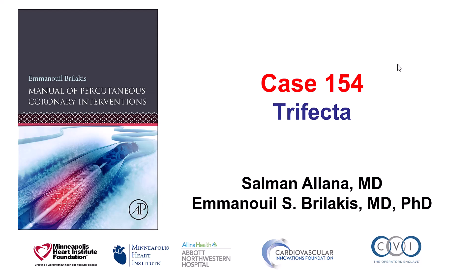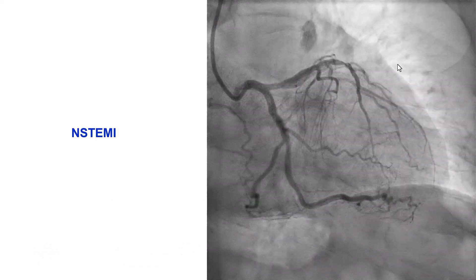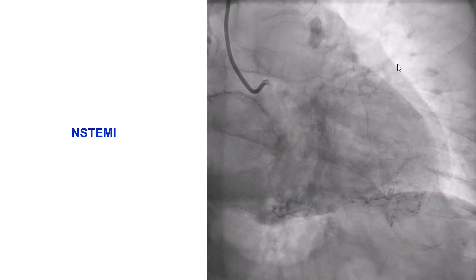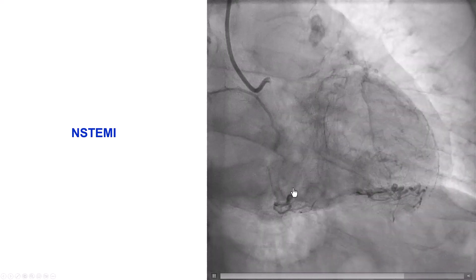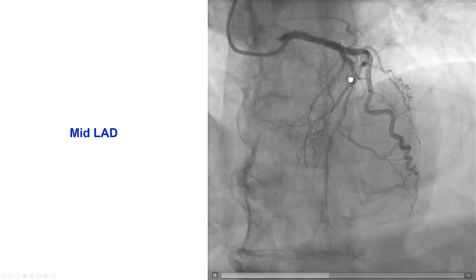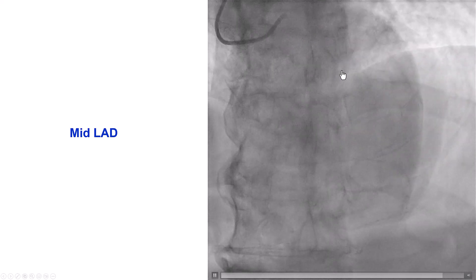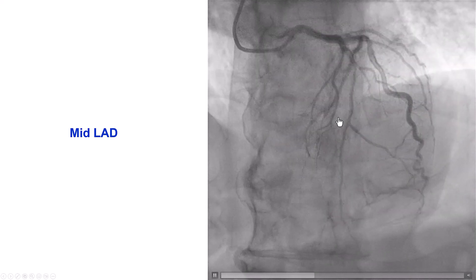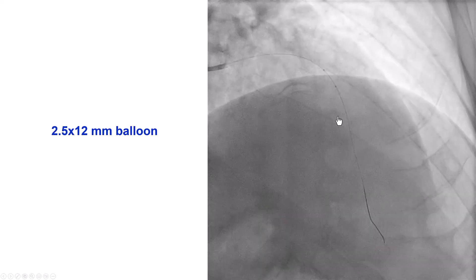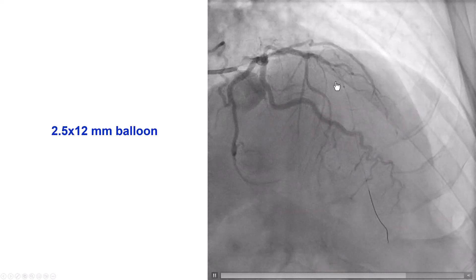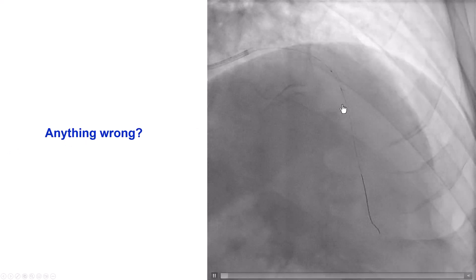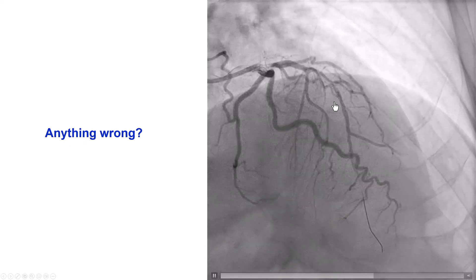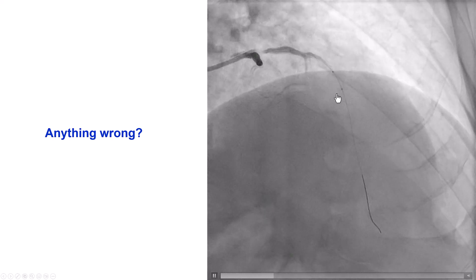This is a case of three complications happening during the same procedure. The patient presented with non-ST elevation myocardial infarction. Diagnostic angiography shows no significant disease in the circumflex; however, he did have a significant lesion in the mid-LAD. There was no significant disease in the right coronary artery, and therefore the plan was to perform a PCI of the LAD, which was predilated with a 2.5 by 12 mm balloon. This is how the lesion looks afterwards, which has some significant improvement.